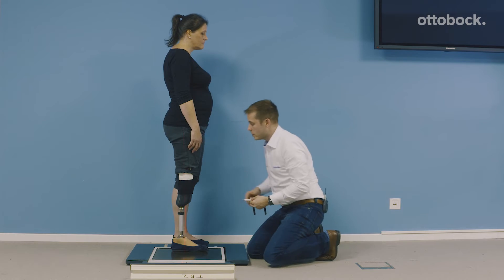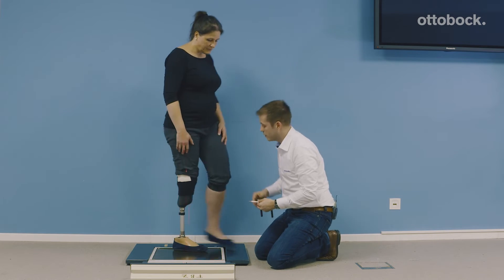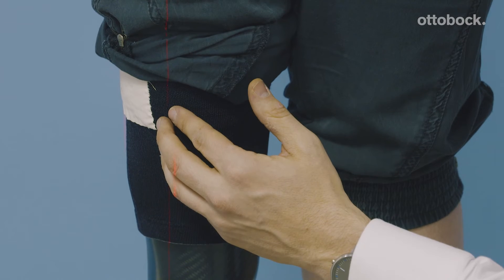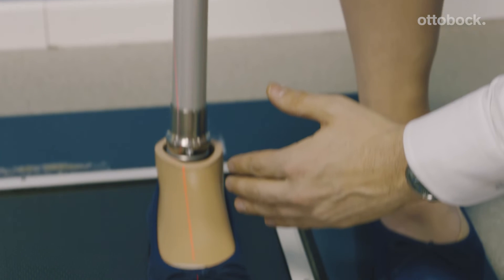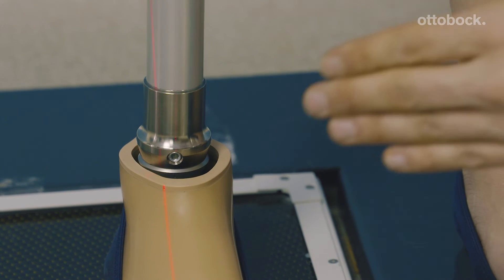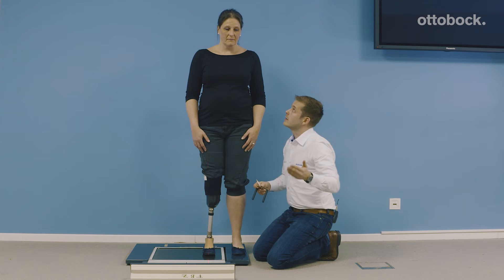The frontal plane alignment is also really important. In the frontal plane, we have to touch the lateral side of the patella. And the foot must be positioned in 5 degrees of outer rotation, because that's really important for the functionality of the foot.